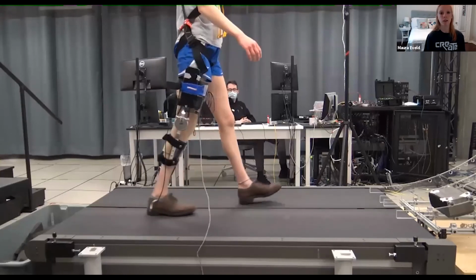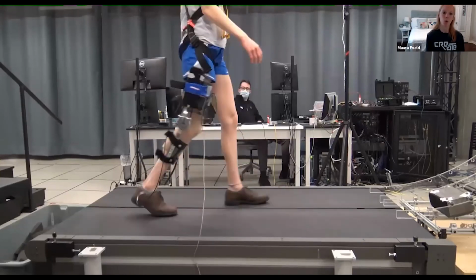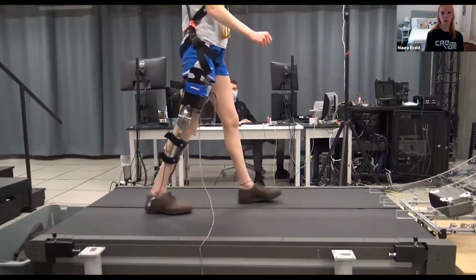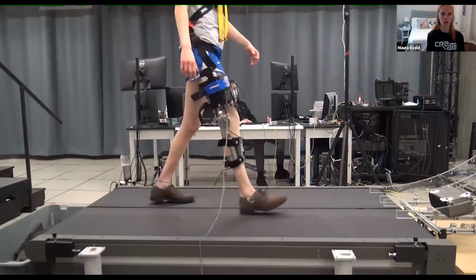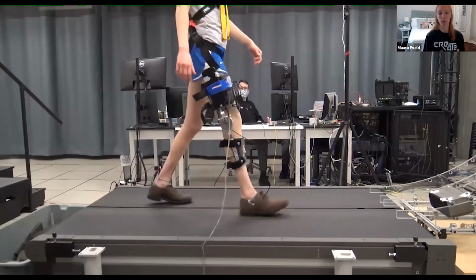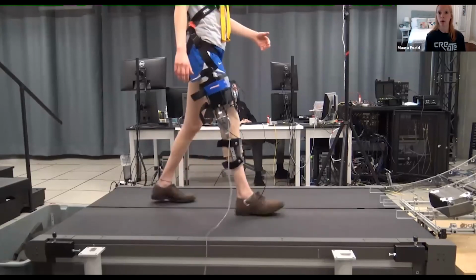Lastly, here is another example of a lower limb exoskeleton. This time it's designed for just one joint, the knee, on just one side. So this type of device is used for individuals with gait asymmetries, meaning they might have muscle weakness on one side due to a stroke or other condition. So the motor at the knee joint can help the user bend and straighten, allowing them to adopt a healthier and safer walking pattern.